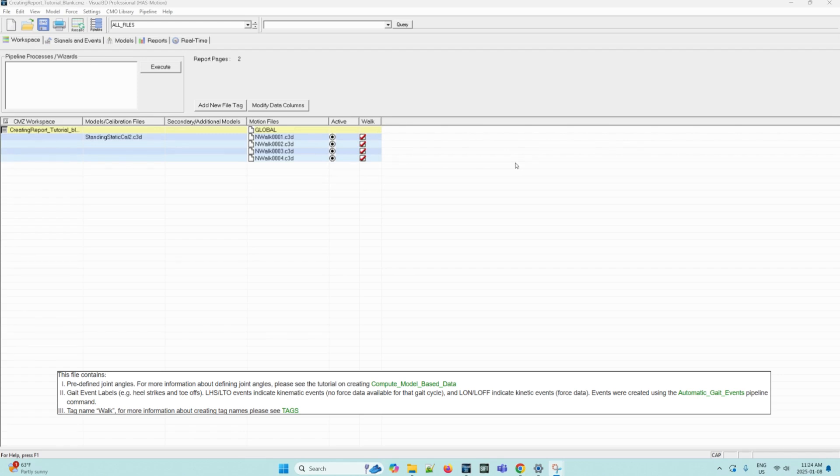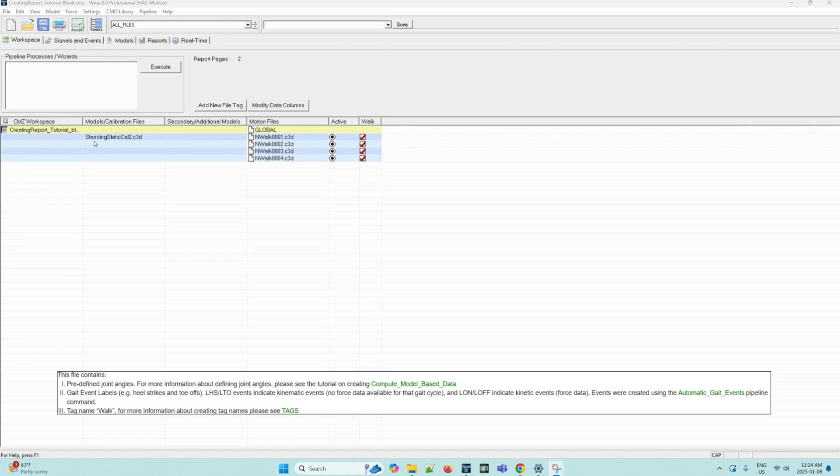The third is the tag name walk. As you can see, this has been applied to all of the motion files here, and our calibration file is here stating standing static cal2.c3d.